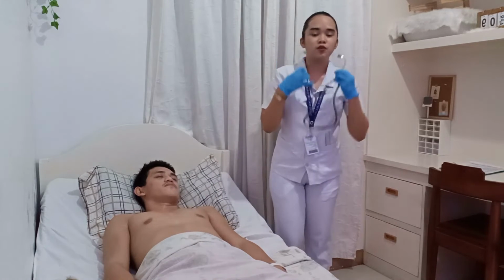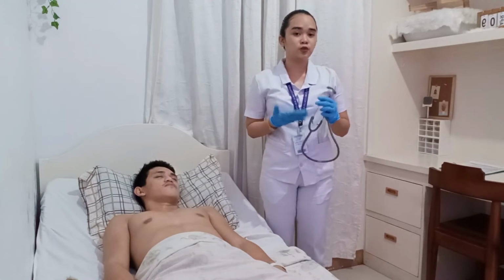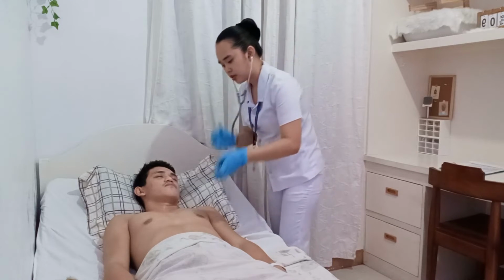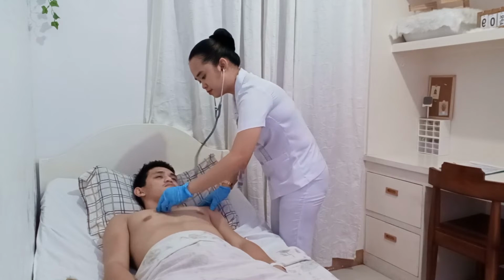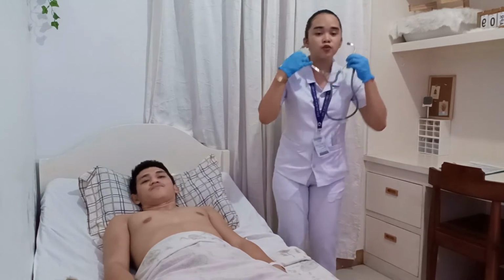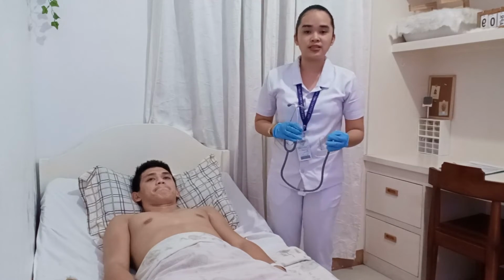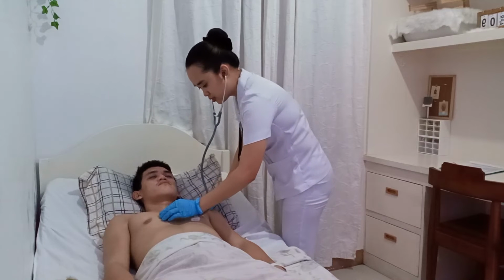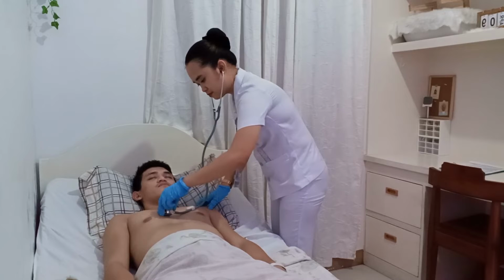Okay. Now I'm going to auscultate for the pulmonic area, which is located at the second intercostal space at the left sternal border. Okay, inhale and exhale. Okay. And exhale. Okay. So now I'm going to auscultate for the tricuspid area, which is located at the fourth intercostal space at the left sternal border. Okay, Mr. Patrick, inhale and exhale. Okay, inhale and exhale.